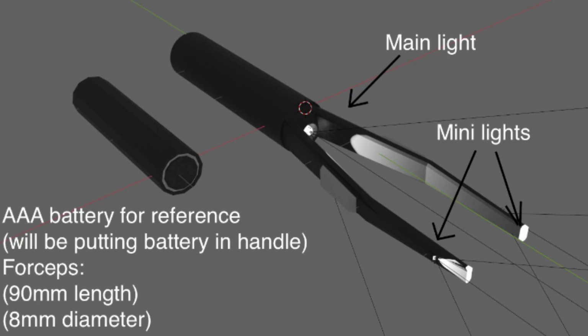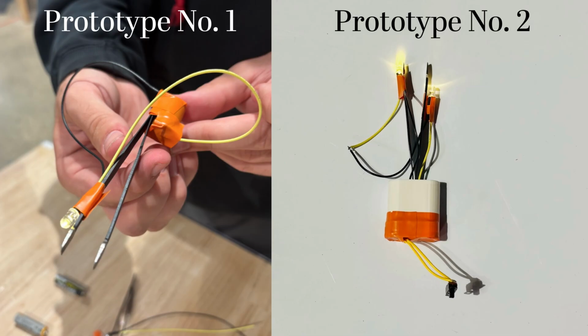Ultimately, we decided on Splinter forceps design due to their effectiveness and ease of use. With such a broad context of use, we needed a design that would be easy for a diverse audience to learn how to use without any prior knowledge or training. Our first prototype was just a pair of Splinter forceps with an LED light taped to the tip, powered by a AAA battery per our client's request.